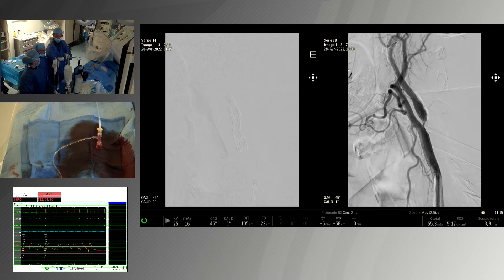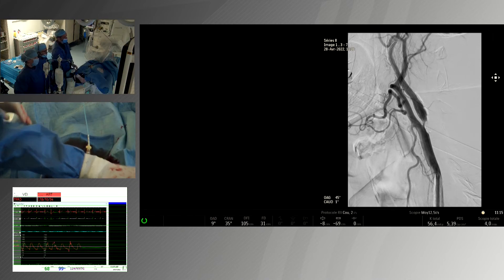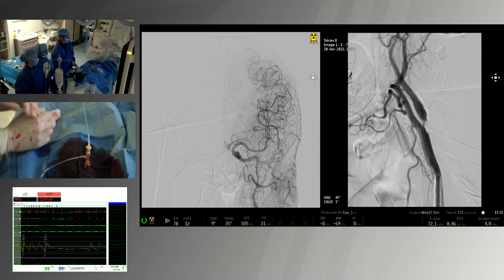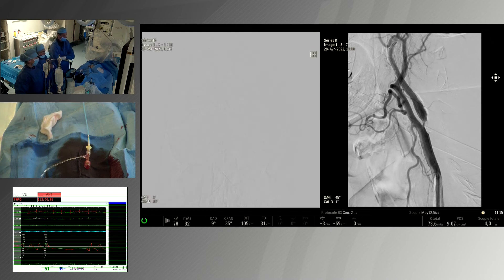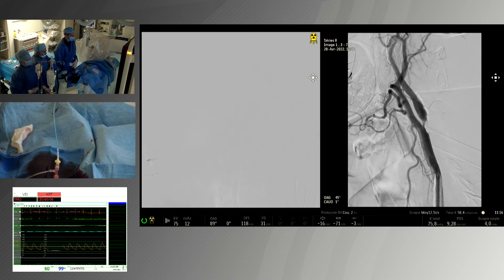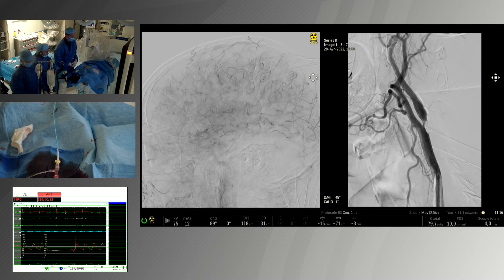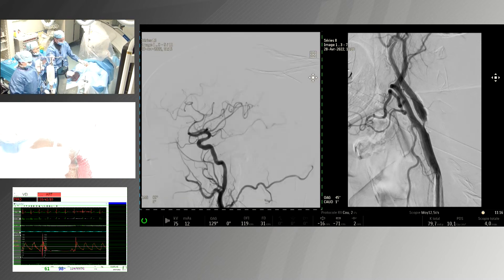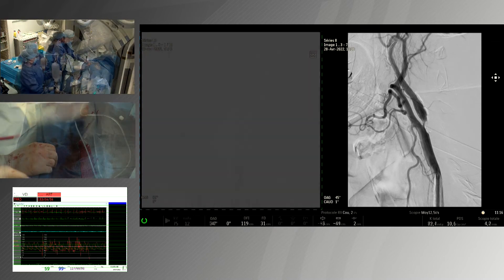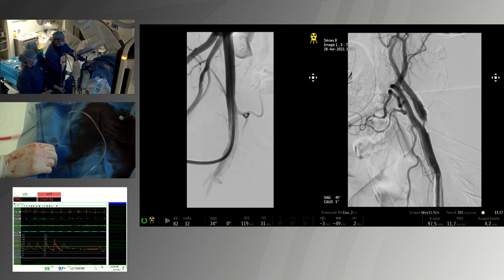The result is beautiful. We are now going to analyze the intracranial result. The intracranial result is very good — left lateral view confirms it is very good. We then check the femoral approach, which is also perfect.